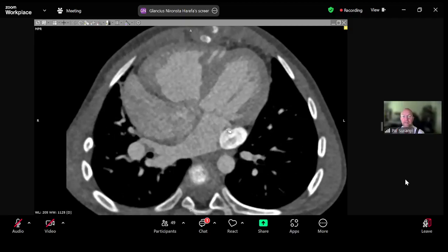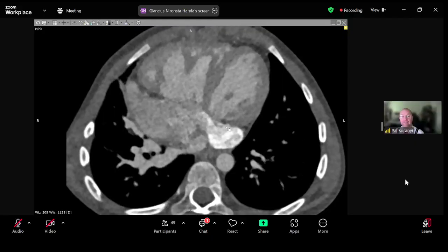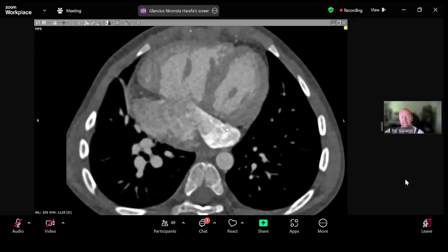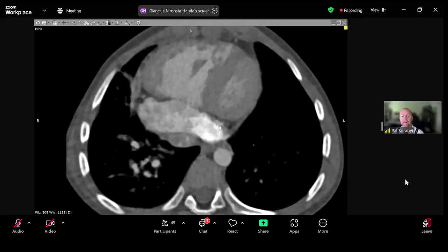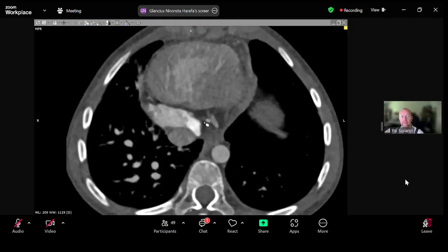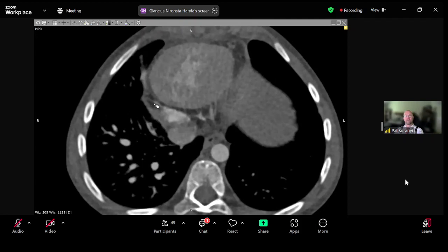Here, things are going to get a little bit motiony and things blur together. But if we keep scrolling down, now we have a big dilated coronary sinus. But behind it, if you keep scrolling, that left circumflex will reveal itself once again. There's a little blurring motion there. Yep, excellent. Great job following that. And truly remarkable. Goes all the way around, gives a posterior descending right there, and then goes all the way around and hugs the hypertrophied right ventricle from below.